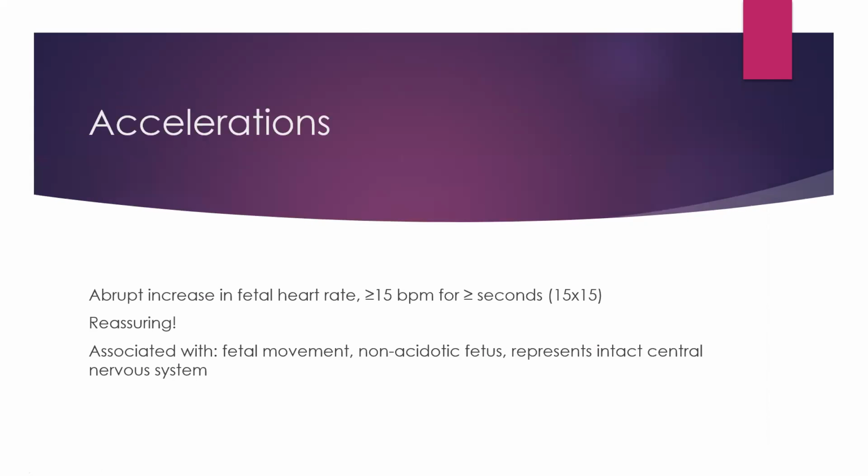Accelerations. Accelerations are actually a good thing. They are a great thing. These are very reassuring. An acceleration looks like an abrupt increase in fetal heart rate greater than or equal to 15 beats per minute for greater than or equal to 15 seconds. So we call them 15 by 15s. If your heart rate is at a baseline and it only goes up by 10 beats from the baseline for 10 seconds, that is not considered an acceleration. It has to go up at least 15 beats from the baseline for at least 15 seconds.